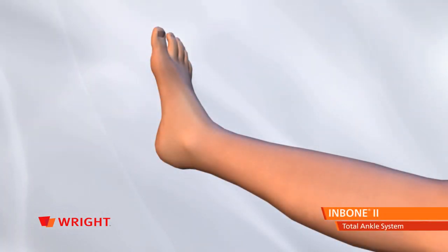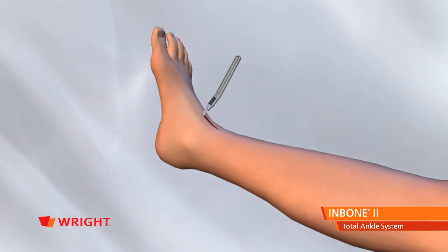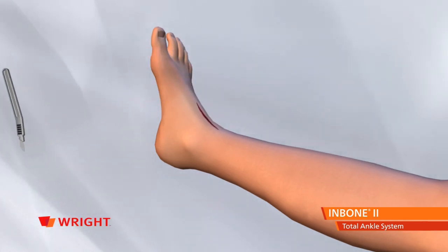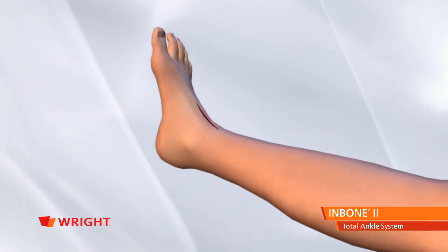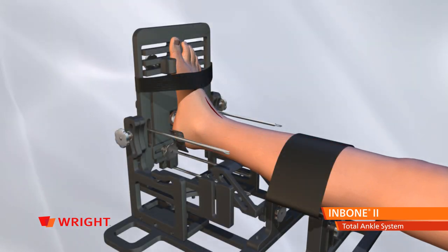To begin, place the anterior incision approximately 125 millimeters long and directly lateral of the tibialis anterior. Expose the tibia, talus, and a portion of the midfoot while avoiding the anterior tendons and neurovascular bundle. The preferred interval is between the tibialis anterior and the extensor hallucis tendon.